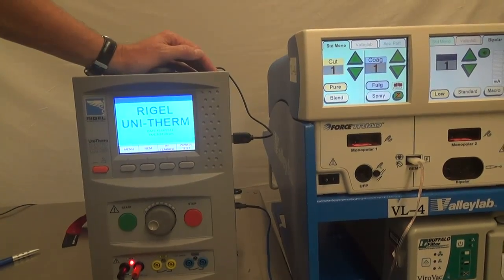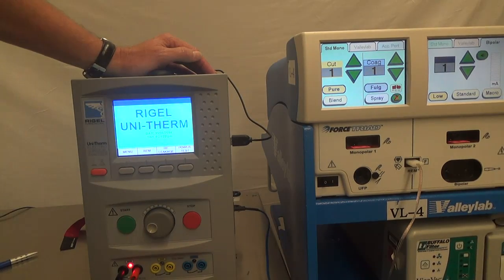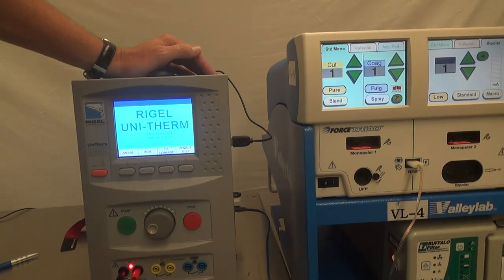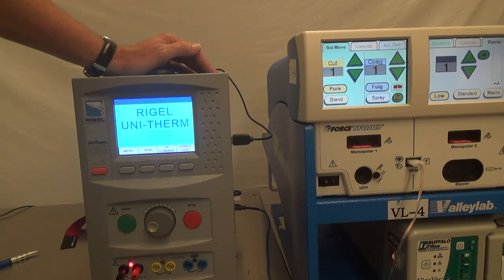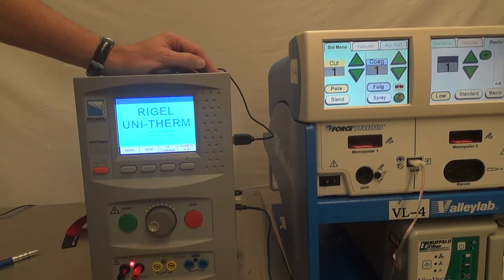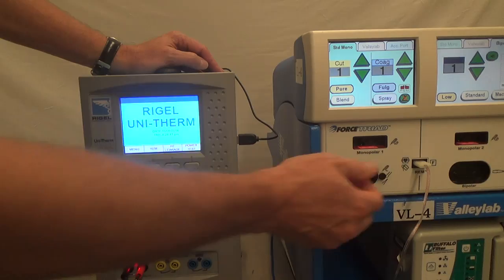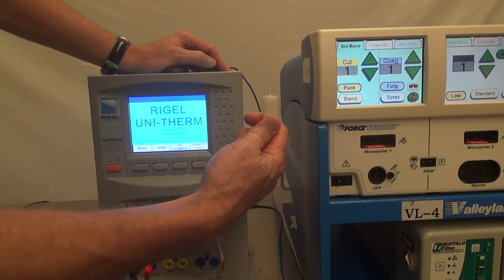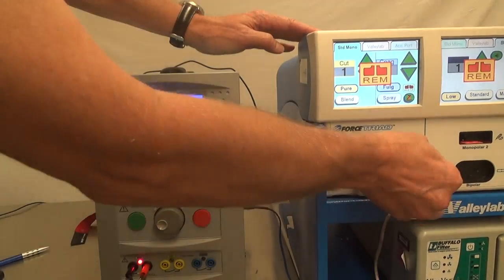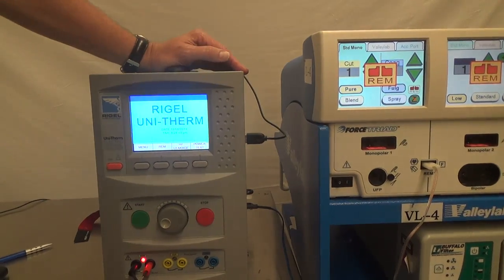So we're going to perform the REM check on the ForceTriad. There's nothing new on the ForceTriad REM check versus the ForceFX check. You still check the upper limit and the lower limit. Test actually stays the same. So you use an REM cable with the index pin still present. You plug that in. There's your REM alarm.